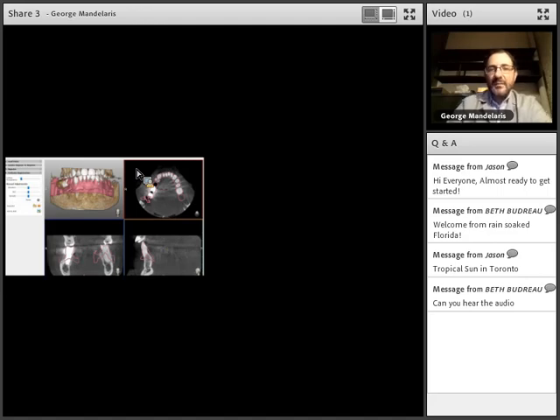Once that's registered, I can then change the planes. So I can fine-tune that registration even more in the X, Y, and Z axis, or the yaw, pitch, and roll, which you see here under manual adjustments on the screen to my left. You'll notice that they're all pretty much in the same vertical column. And they're not exactly accurate.